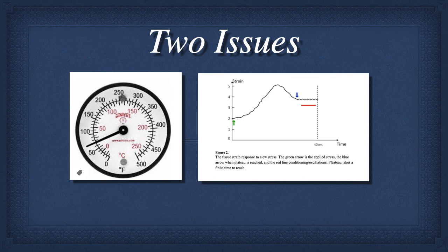So the elastography work at slow rates works well when you are not trying to do it at the speed you do it in a coronary artery. But when you're doing it with a coronary artery, you have to take into account that once you apply the pressure, you've got to wait at least one more frame to take the measurement. And we proposed in that paper the alternate frame technique. But elastography, so you're looking at two techniques.